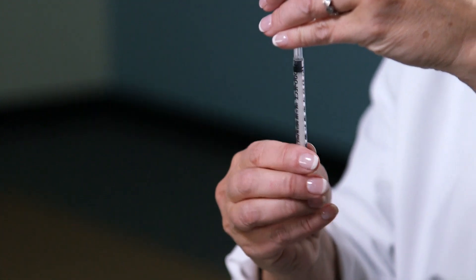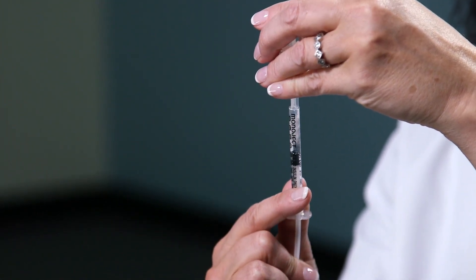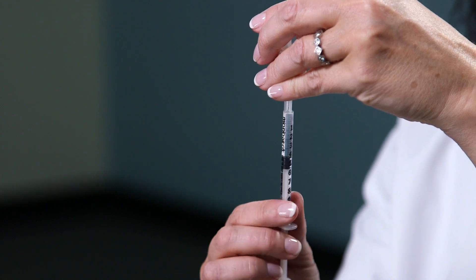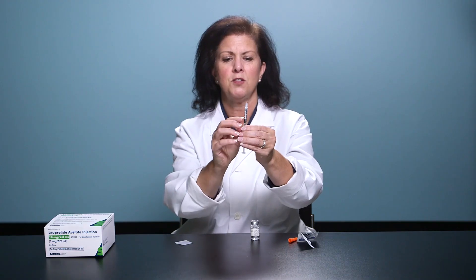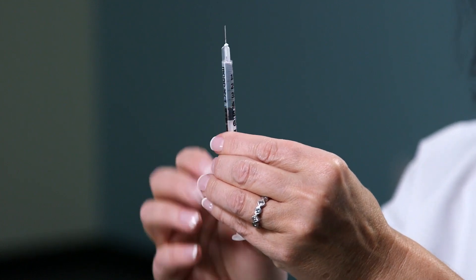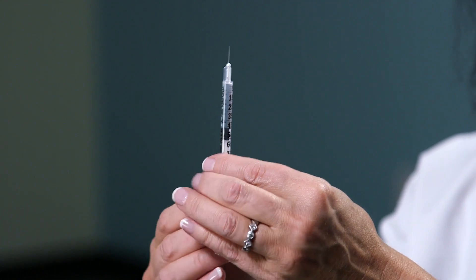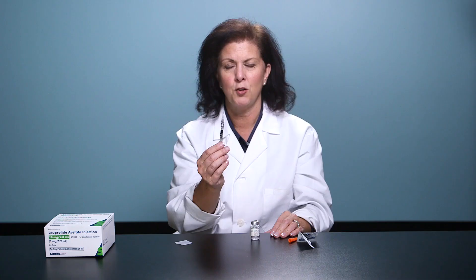Tip the vial over and draw back your prescribed dose. Tap the syringe to force any bubbles to rise to the top, and press on the plunger until you see a droplet form at the tip of the needle. You're now ready for your subcutaneous injection.